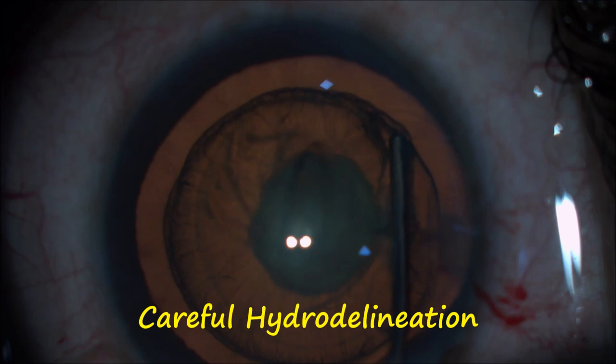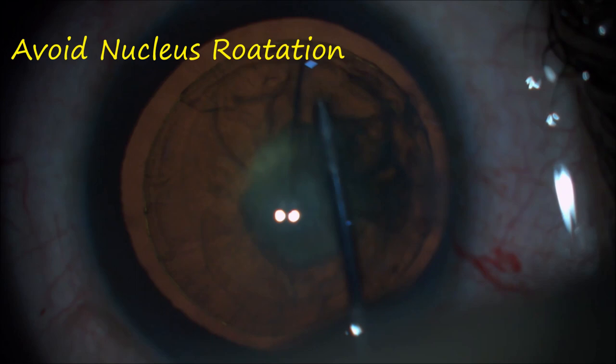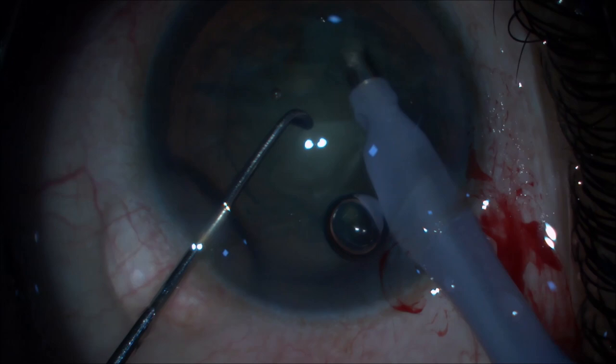A gentle hydro delineation is performed. Appearance of the golden ring indicates a good hydro delineation. Attempt to rotate the nucleus should be avoided as it can cause posterior capsular rent.